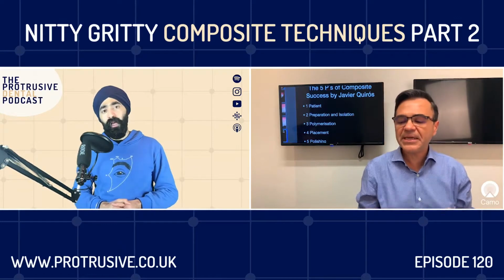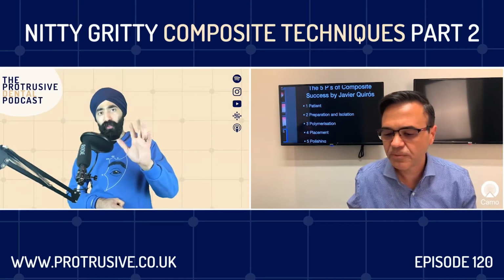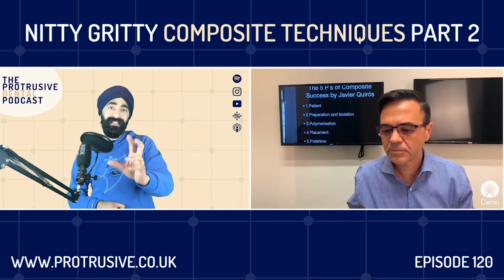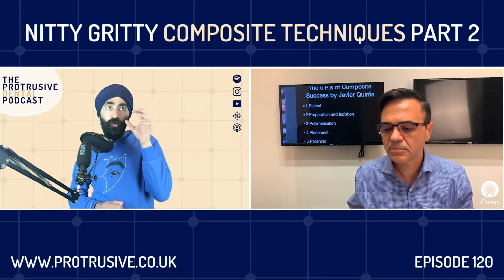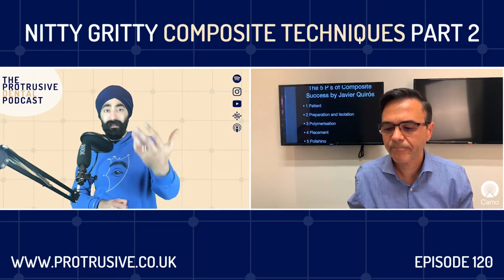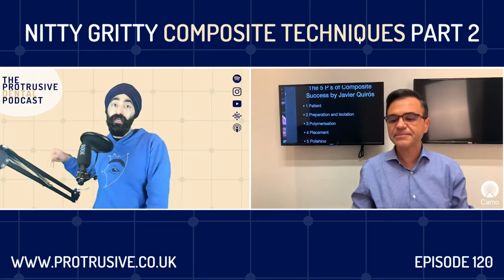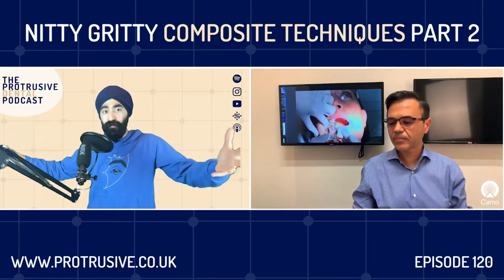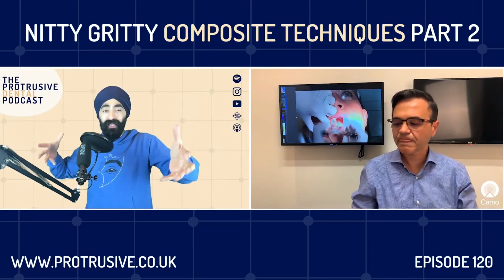Then the number 3. Just want to stop you on isolation, if you don't mind, Javier, because those who are listening may not have seen the cases you are sharing. It looks like you are preferentially going towards split dam technique, because obviously when you're doing veneers all the way up to the gingival margin, it's very difficult to actually go with a normal full rubber dam. So am I right saying that you're doing split dam technique?